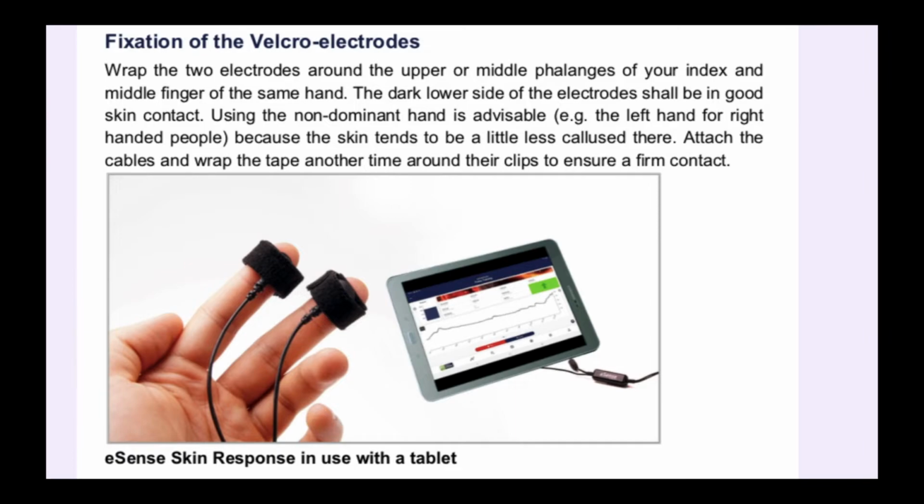For the interpretation of the measurement, we distinguish between tonic and phasic effects. The tonic component is the longer-term average of skin conductance and its development during one session. Values for the tonic level can vary between 1 to 15 microsiemens, depending on the individual and the situation. In contrast, rapid changes, fluctuations of skin conductance often caused by sudden stimulus, but also appearing spontaneously, are the phasic components of the skin response.